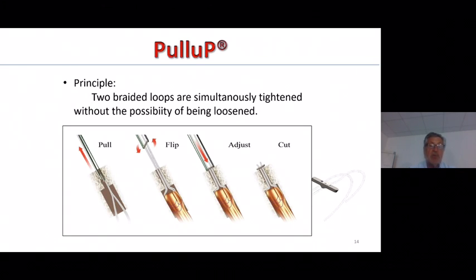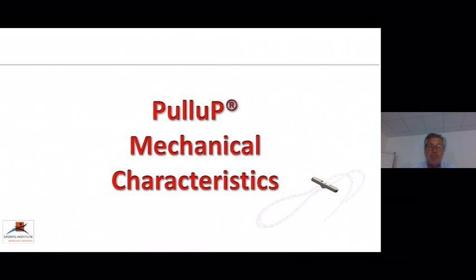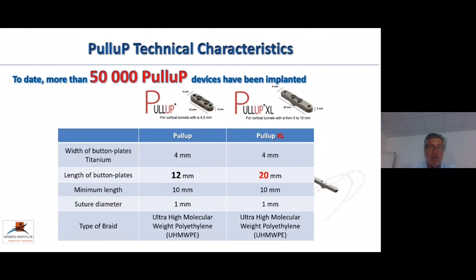The principle: two braided loops are tracked through the tibial tunnel with the platelet in a longitudinal position, and then the platelet outside the external cortex of the femur, you flip the platelet and adjust the system, so everything is locked and you just have to cut the excess of thread. That is the commercial presentation, and it is easy to use. And some words about the mechanical characteristics of such a device.